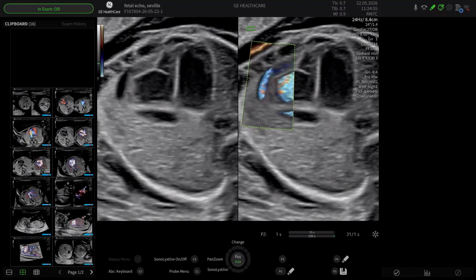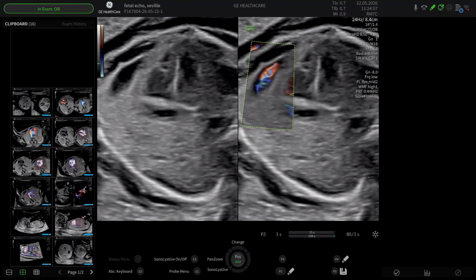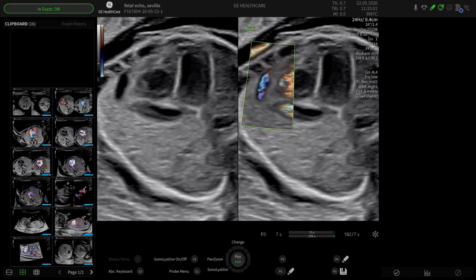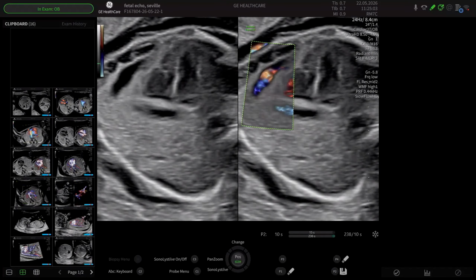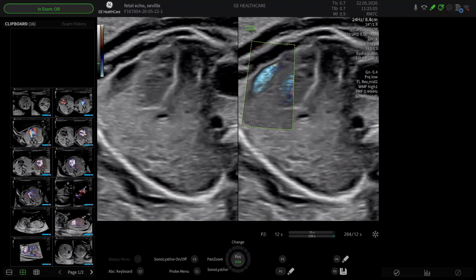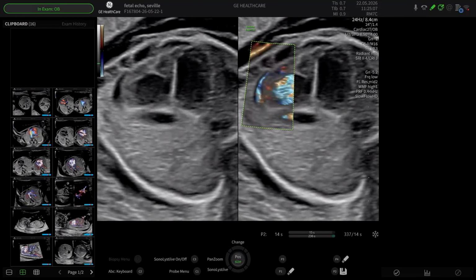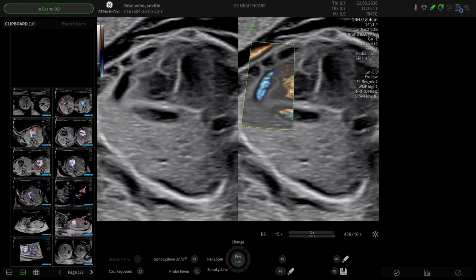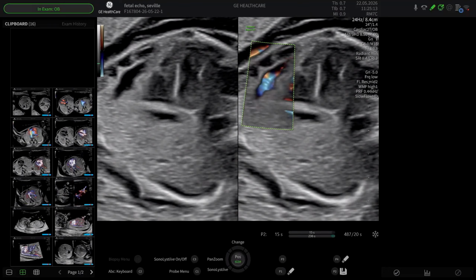There are times where we are faced with, in obstetric imaging, seeing what we think is pericardial fluid, but in fact, it's not pericardial fluid. It's actually sometimes myocardium can mimic a pericardial effusion. Very quickly, slow flow will give you an answer whether that's muscle or whether that's fluid within the pericardial space.